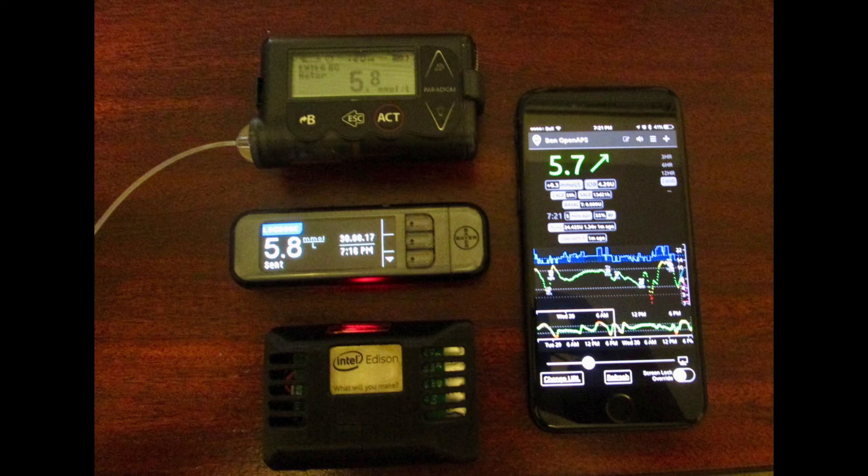So the take-home message here is that this thing is automatically setting temporary basals on my pump. I don't have to do any work — it reads my blood sugars and it automatically adjusts my insulin levels. That's the system I wanted to share, and it's called Open APS. It stands for Open Artificial Pancreas System.